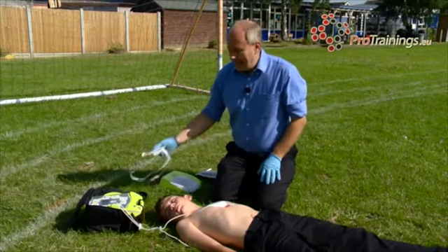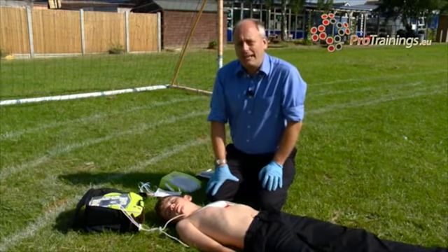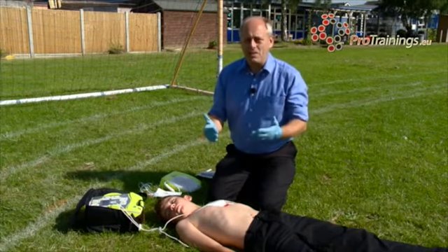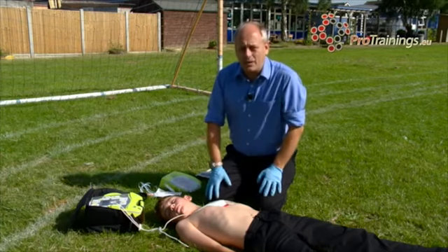Now, a standard AED unit that you may well see in shopping centres and things like that may not even have pediatric pads in it, but we do need to give the child a shock. So in those instances, we would use the adult pads. If you haven't got pediatric pads, you're going to have to use adult ones.